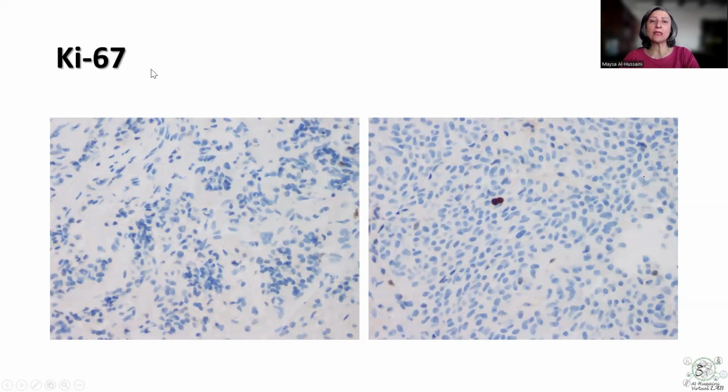Ki-67, I tend to do Ki-67 in cases of pituitary gland, although per WHO, this is not really usually recommended, but sometimes if I encounter an increased proliferative activity, more than 10%, I tend to report it and mention this clearly in the report. And this is the normal pituitary gland, hardly, if any, proliferatively active cells, while in the tumor, it's only occasional tumor cells positive, something like less than 2%, less than 1% eventually.